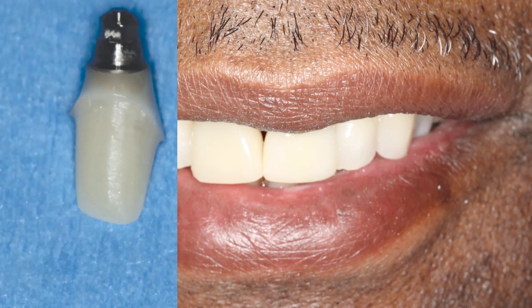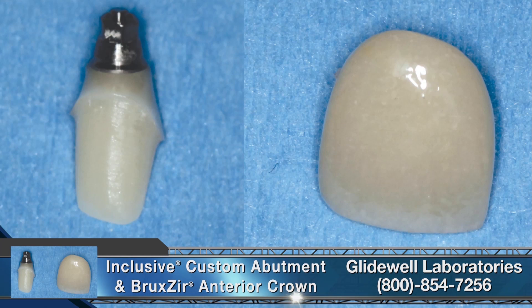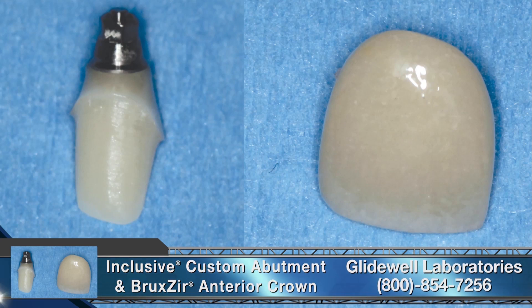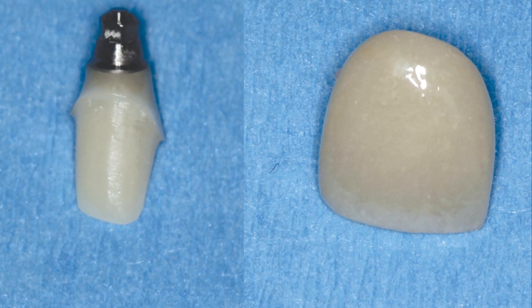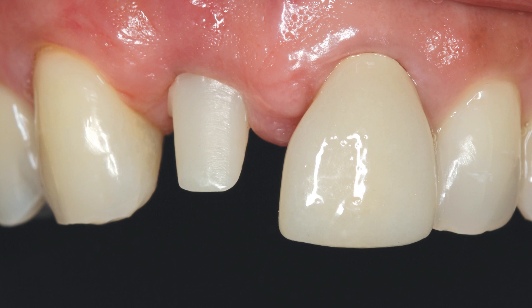Following patient approval of the provisional restoration, our lab fabricated an Inclusive zirconia custom abutment with titanium base and an aesthetic BruxZir anterior crown. Utilizing the latest dental CAD/CAM techniques, the custom abutment and crown were produced with precision, allowing the final restorative components to be seated with minimal adjustment. The custom abutment was tightened to full seating using a torque wrench and provided an aesthetic substructure for the final all-zirconia crown. Because BruxZir anterior crowns exhibit translucency similar to natural dentition, the custom zirconia abutment helped maintain lifelike results.